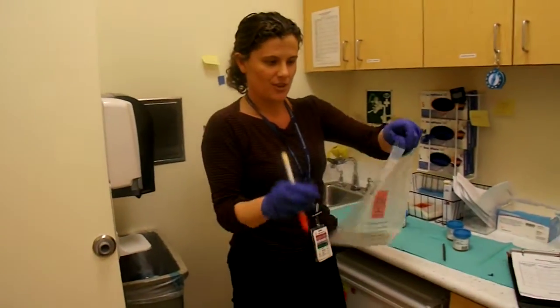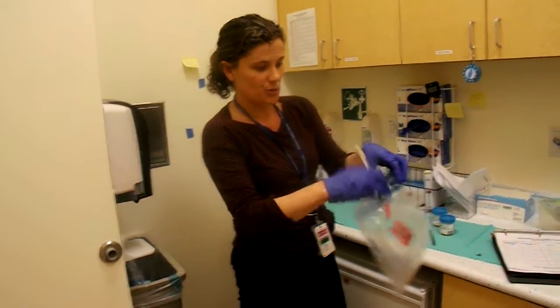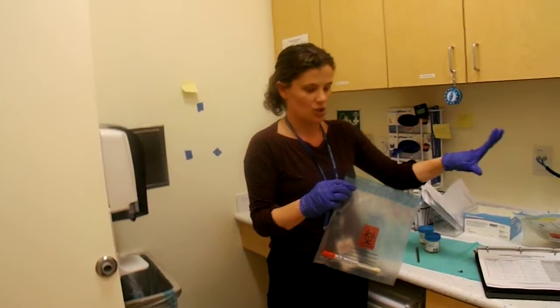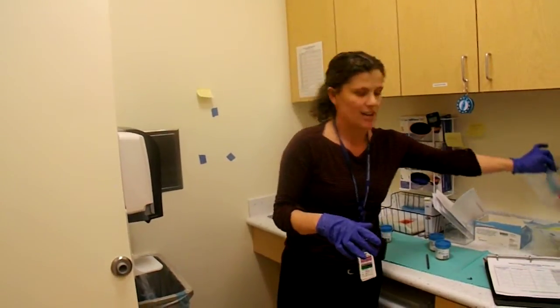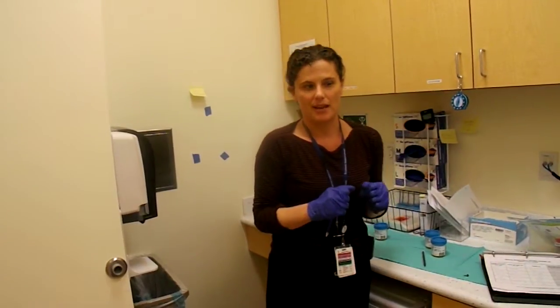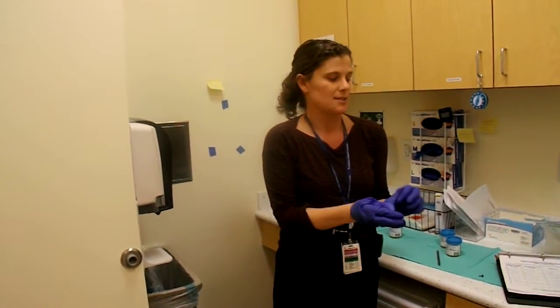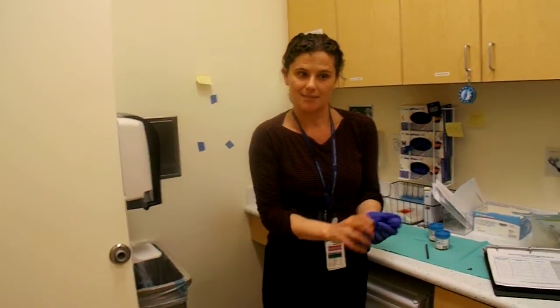Then you put it in a bag. These are the biohazard bags. You put it in. The order should be right here, potentially, or on the printer. You put that in, and you leave it here for the MAs to bring to the lab. And then if you have any questions, you can always ask.